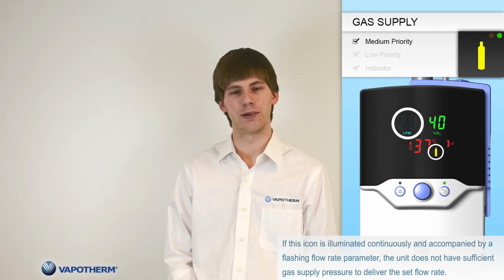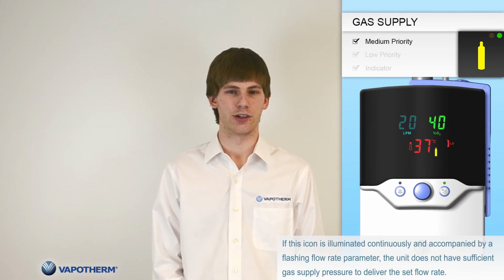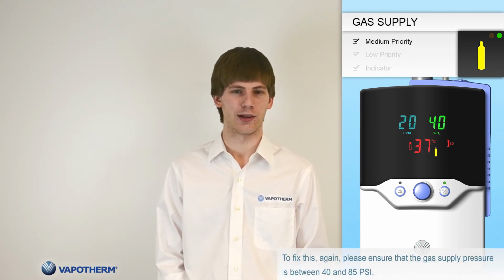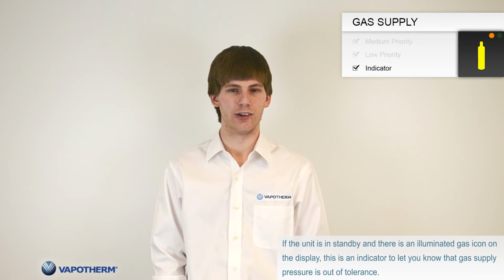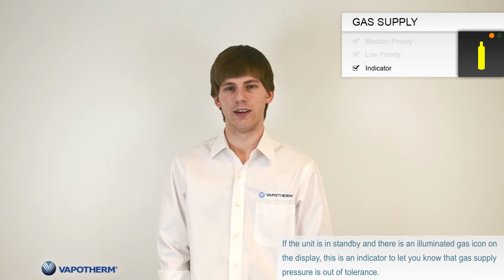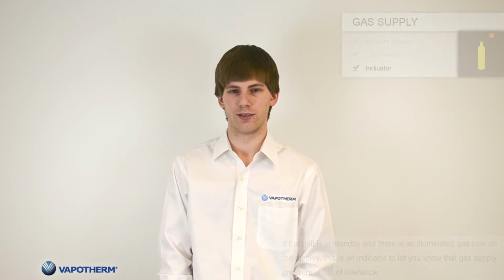If this icon is illuminated continuously and accompanied by a flashing flow rate parameter, the unit does not have sufficient gas supply pressure to deliver the set flow rate. To fix this, again, please ensure that the gas supply pressure is between 40 and 85 psi. If the unit is in standby mode and there is an illuminated gas icon on the display, this is an indicator to let you know that the gas supply pressure is out of tolerance.